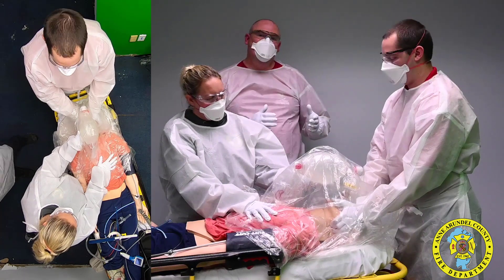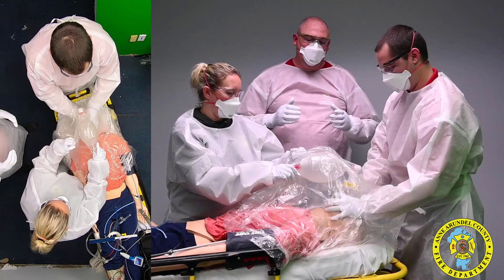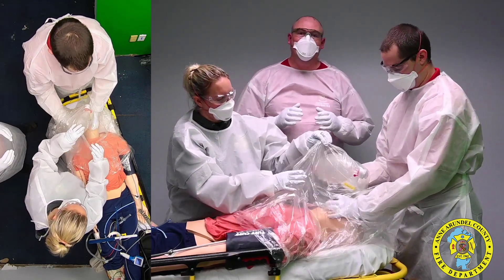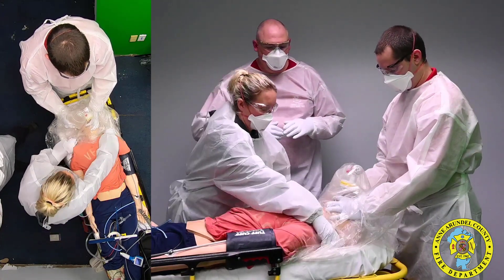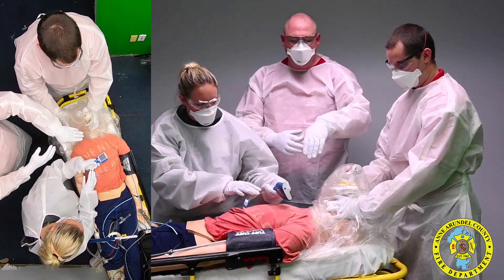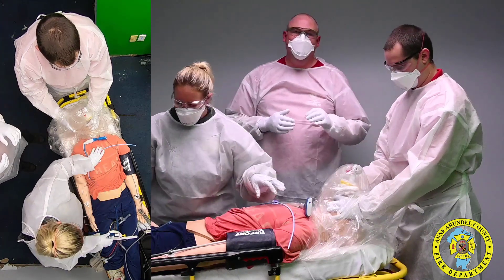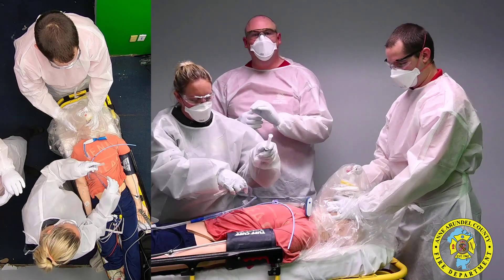At some point you may need to move into an advanced procedure. At the guidance of MIMS and Dr. Wendel, we can move directly into a supraglottic airway or an ET tube. When you make that decision, you can see our clinician pushing the plastic down and out of the way, covering it around the patient's neck. She is going to set up her equipment to optimize for first-time success, whether that is a supraglottic airway or an ET tube.